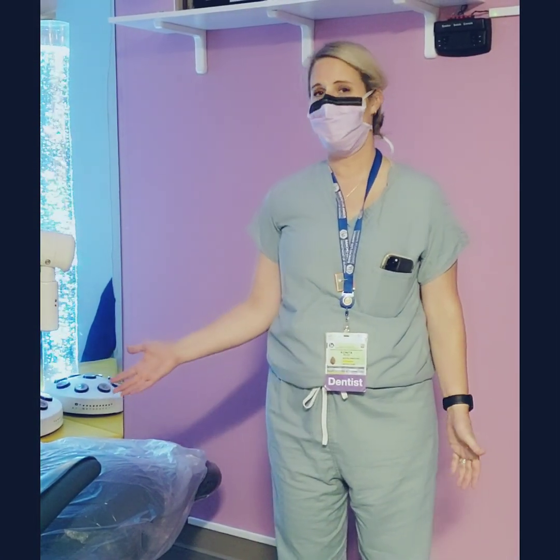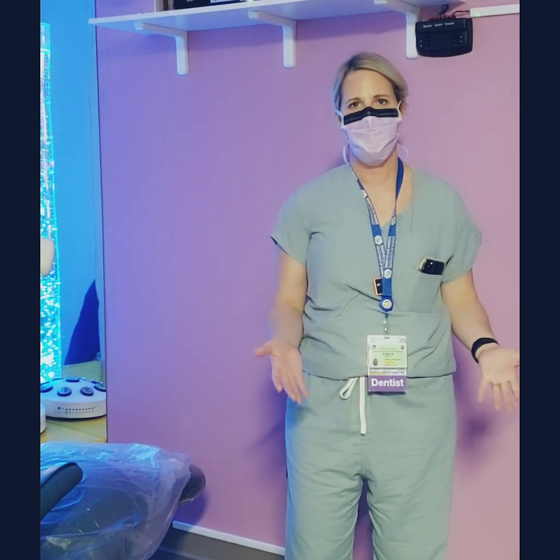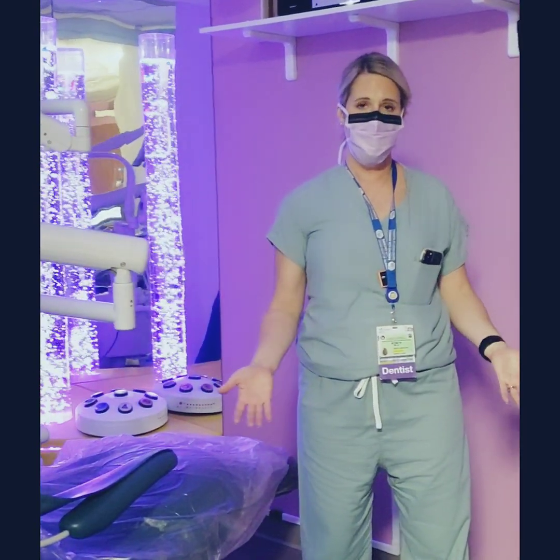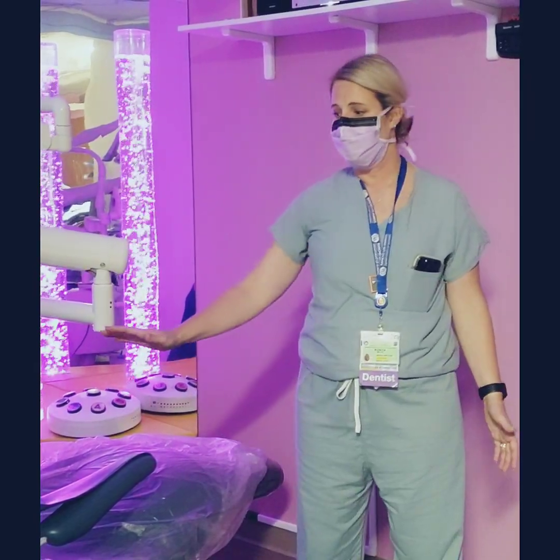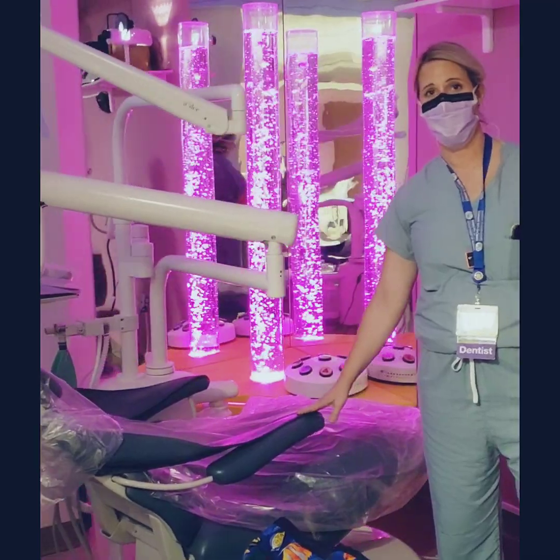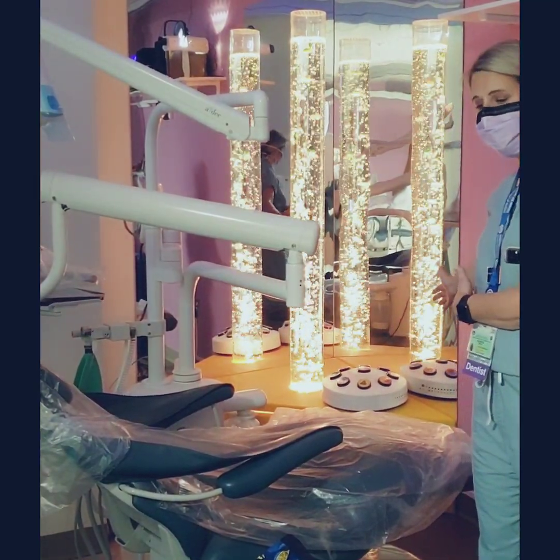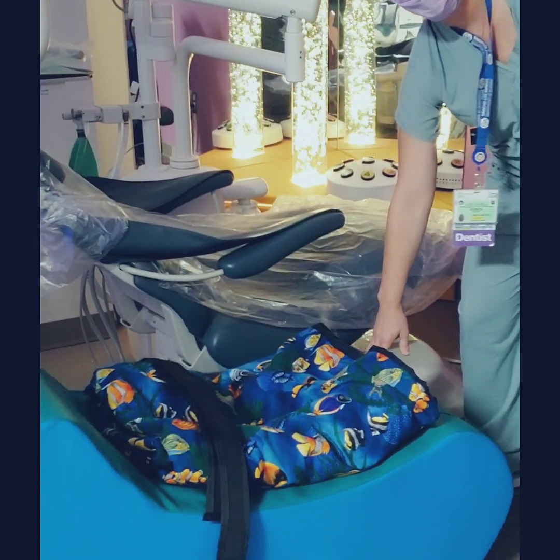Okay, so one of the biggest challenges that we've had in the past is even getting our patients who might be a little timid, frightened, into the dental chair. So as an adjunct to the sensory room, we've provided a lot of different alternate seating. One of the advantages of these chairs that we have here at Rancho is that they are completely movable. So we can easily move this chair against the wall and replace it with this soft rocker.